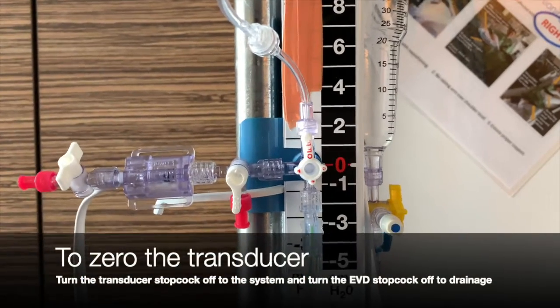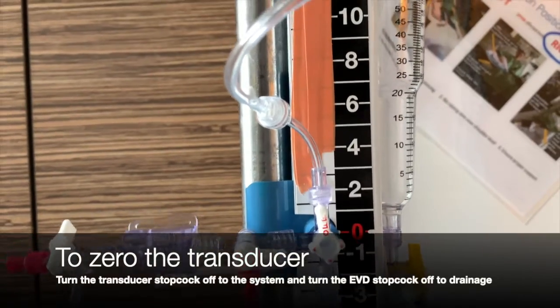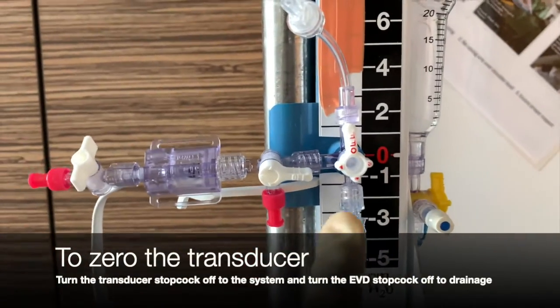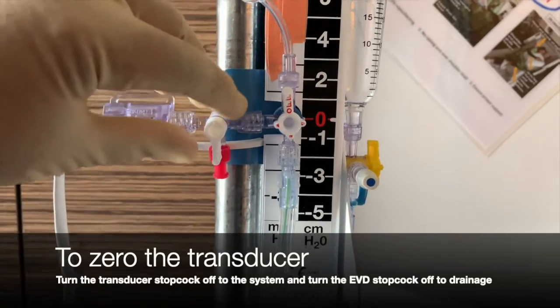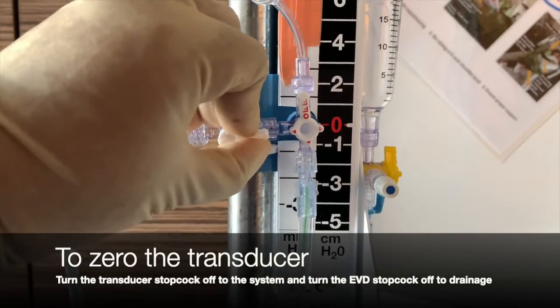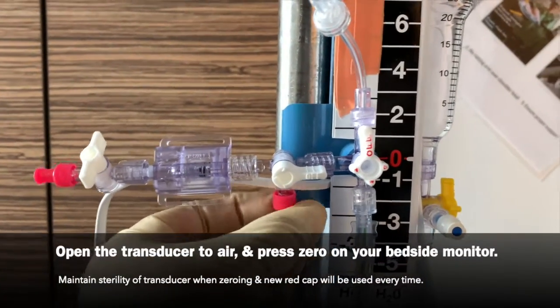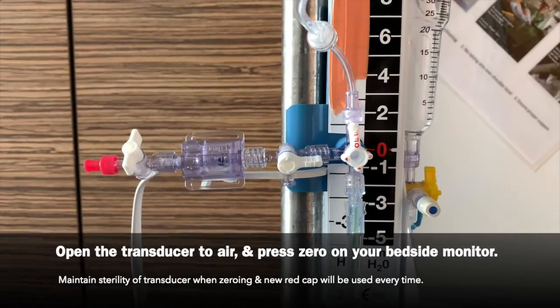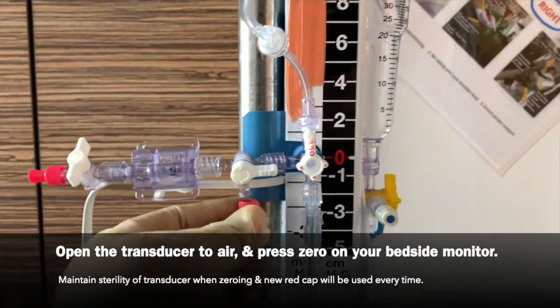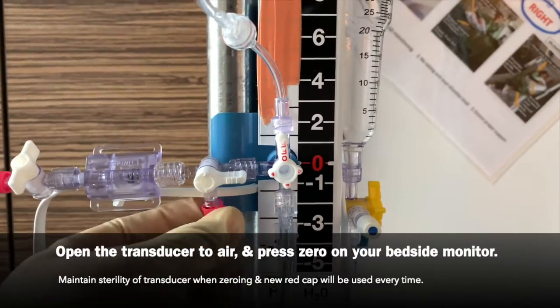To zero the transducer, turn the transducer stopcock off to the system and turn the EVD stopcock off to drainage. Then open the transducer to air, press zero on your bedside monitor, and maintaining sterility of your transducer, place a new red cap every time.